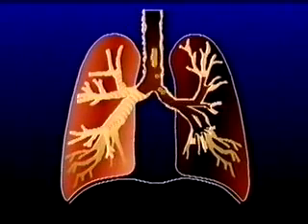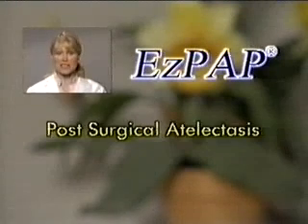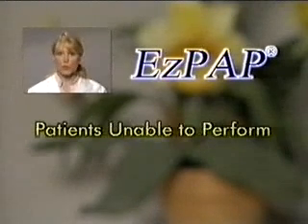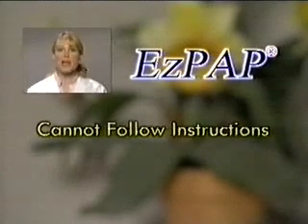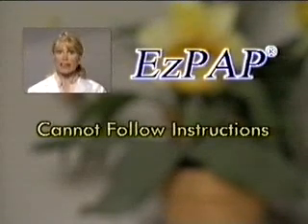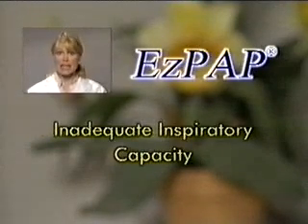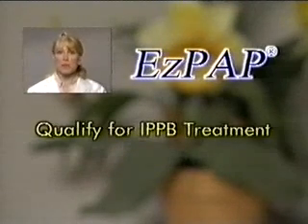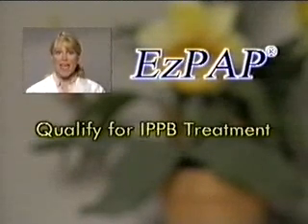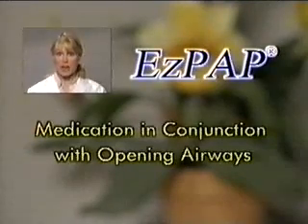Those who benefit from the use of EzPAP include post-surgical patients who develop atelectasis, patients who are unable to perform deep breathing exercises due to pain or non-cooperation, patients needing lung expansion therapy that cannot follow instructions, patients requiring lung expansion but with inadequate inspiratory capacity, less than 10 cc's per kilogram, patients that qualify for IPPB treatment of atelectasis, and patients requiring aerosol medication in conjunction with opening the airways.